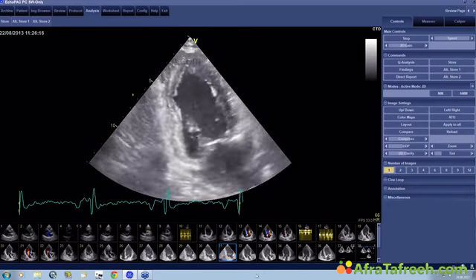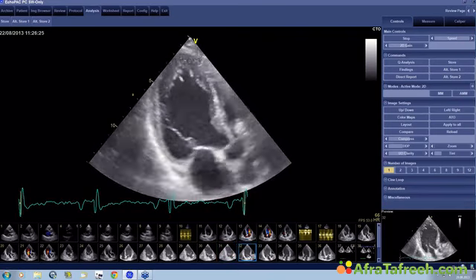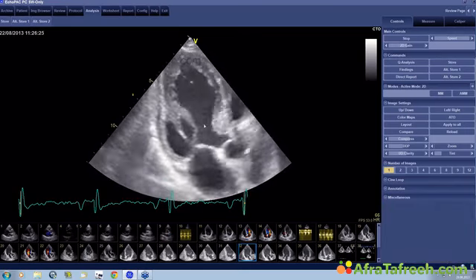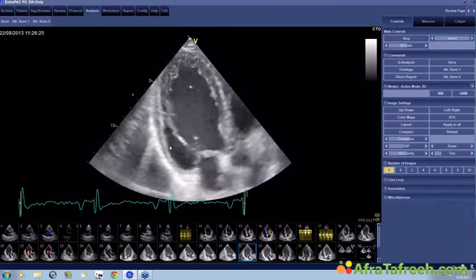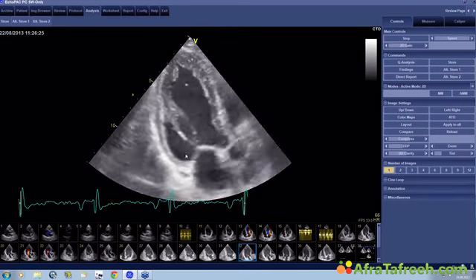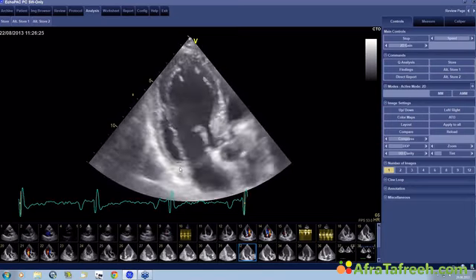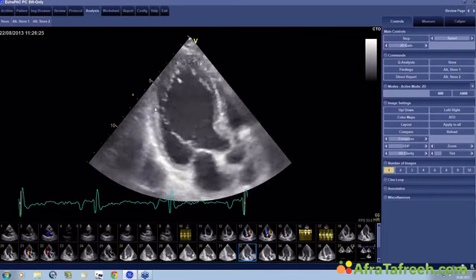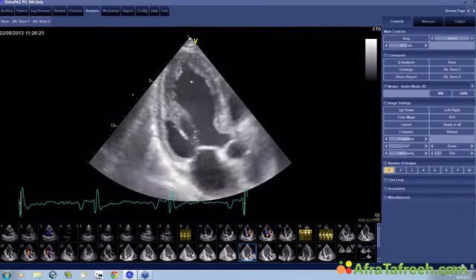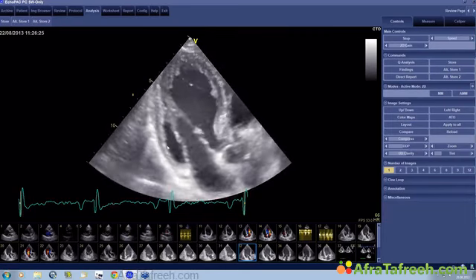The next thing you have to look at is the thickness and the echo density of the myocardium. Right here, it's rather thin. You see that there is a myocardium which is not even half as thick as the septum. And this means that there is a scar. What does that tell you? It tells you the infarct is old. It's not a fresh infarct. There is fibrosis. And it will tell you that there is no sense in revascularizing this region.